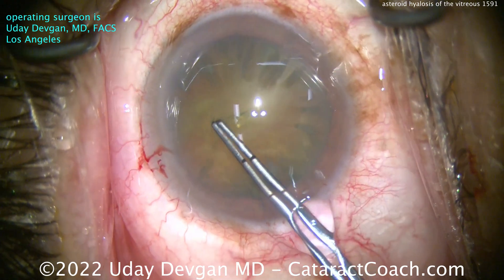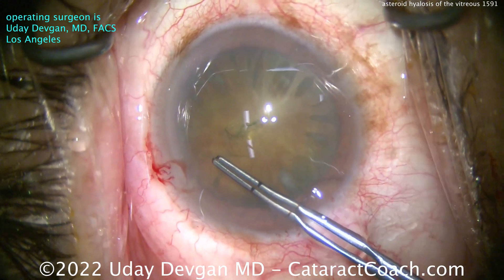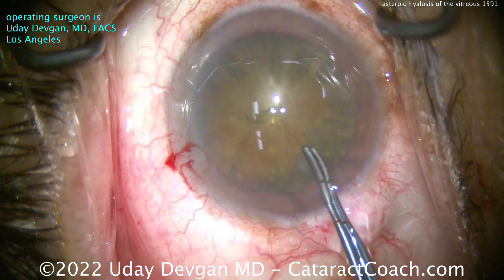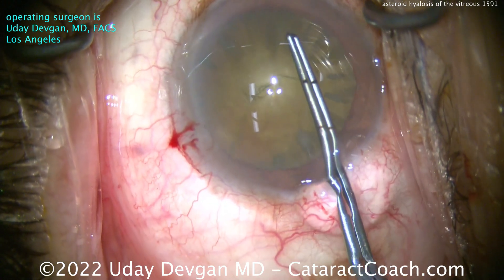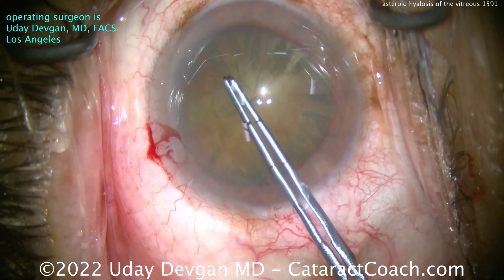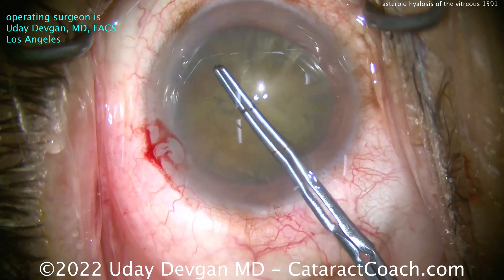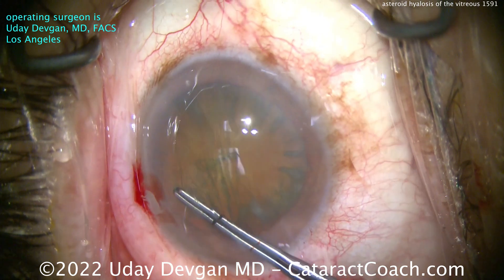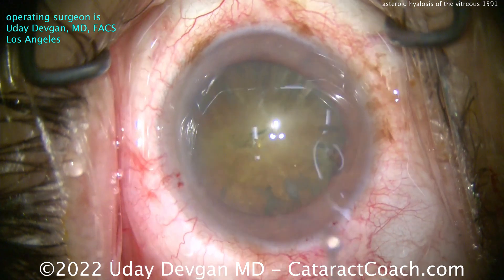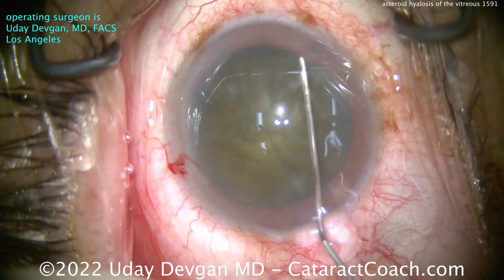The eye has just gotten used to this — it's what the eye knows. It's had vitreous opacities like these asteroid hyalosis bodies forever, and as a result the patient doesn't notice it at all. It does impede our view of the retina, because as light goes in the eye and through these little crystals — these deposits of calcium phosphates or phospholipids — you can see that it changes our view. So certainly, as light goes in the eye for the patient's vision, it must also cause this refractile effect and must also limit image quality.